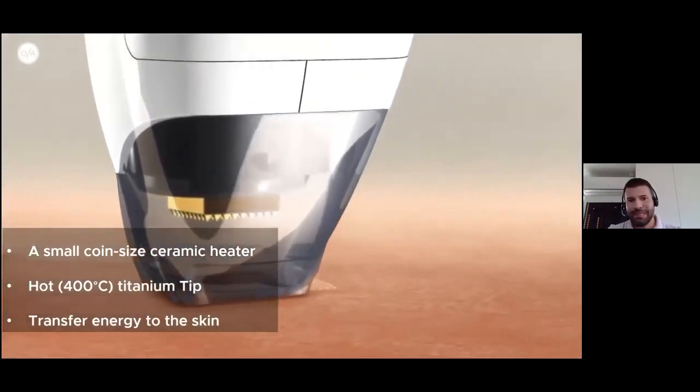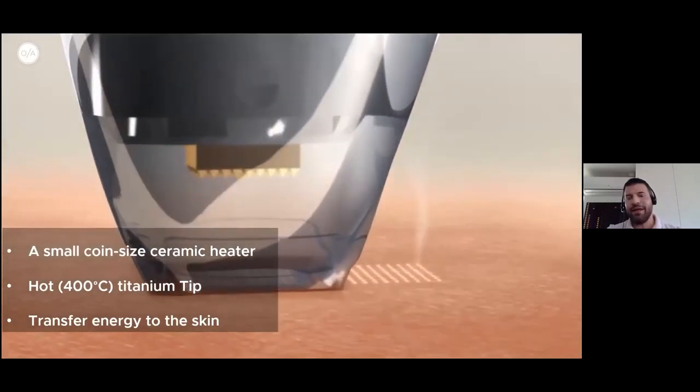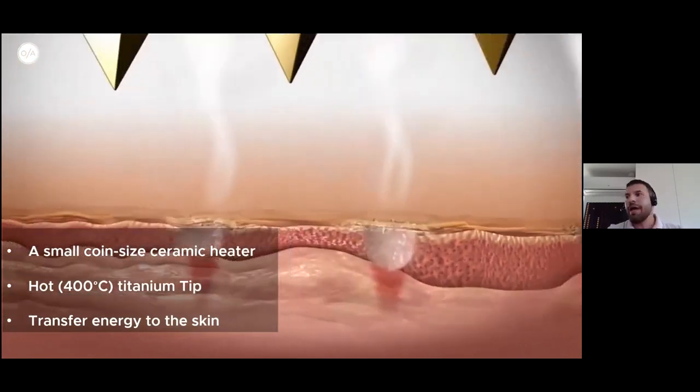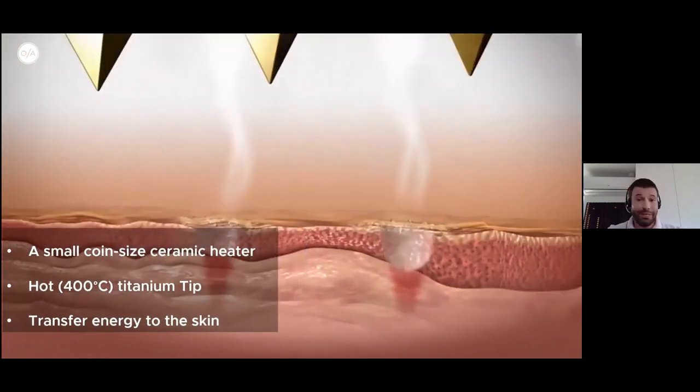So as you can see, and please have a look, when it is not used, the tip, now you can see the tip is getting out and in from the handpiece. So when not in use, the tip is positioned at a distance from the skin, and by activating the handpiece, a linear motor rapidly advances the preheated tip, a 400 degrees titanium tip, to the skin surface at a predetermined protrusion. We're going to talk about it in a second, for a brief duration.